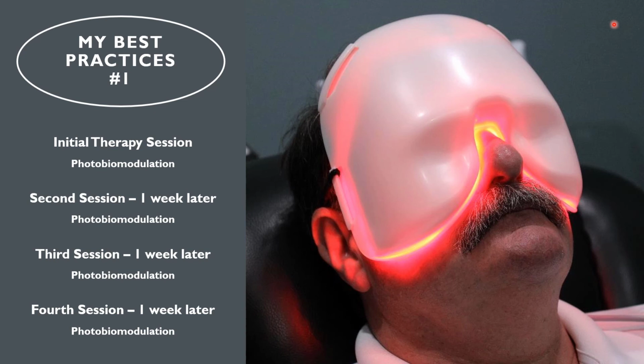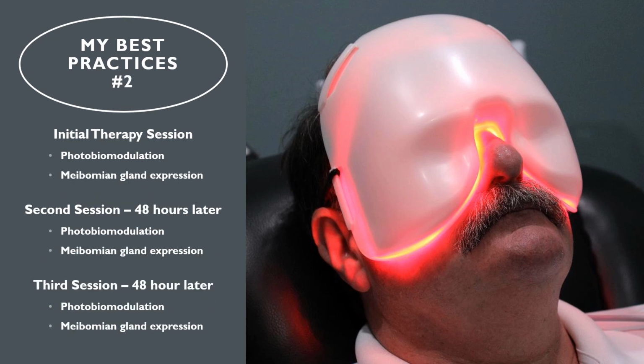What I've seen and what I've read, this stuff doesn't last forever. Nothing lasts forever. It can wear off. It depends on the person. I'm 7 months in now. I've seen some people where the effect has worn off, and I've already had some people where we've gone through a second round of treatment. Most of my patients that I started treating in October, November, I haven't seen them since. They're fine. So what you've got is one visit, two, three, four, and a fifth visit a month later. So that's one way to treat meibomian gland dysfunction.